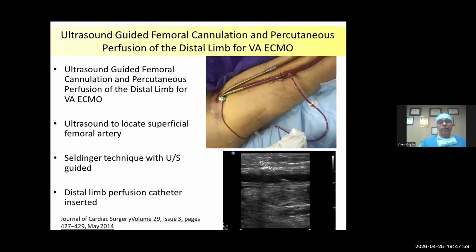So ultrasound guidance is a must, because you understand that there is no peripheral vascular disease. You can measure the size and it is guided, so the chance of injury or vascular damage is minimal.